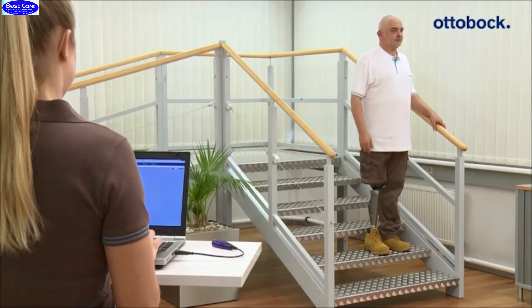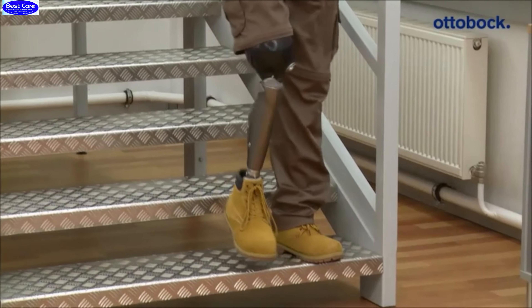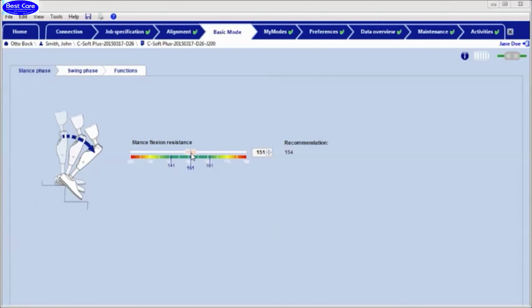In the next step, the stance flexion resistance has to be checked while going downstairs. The value should meet the patient's needs. If the patient has the feeling that he is sinking down too fast, for example, the value can be adjusted in small increments via the software.